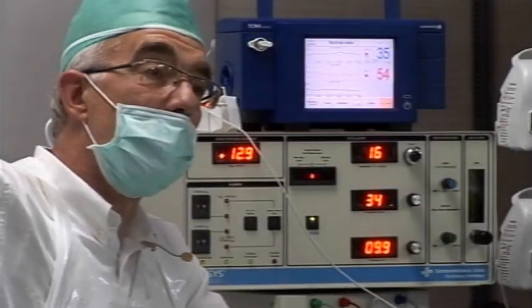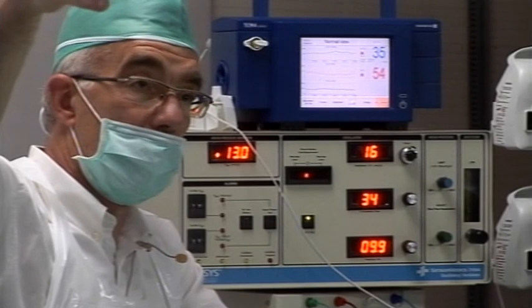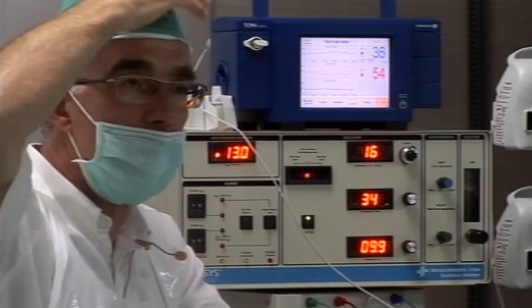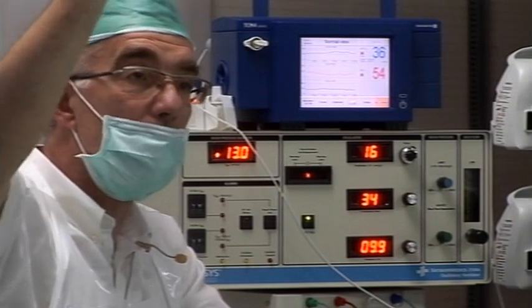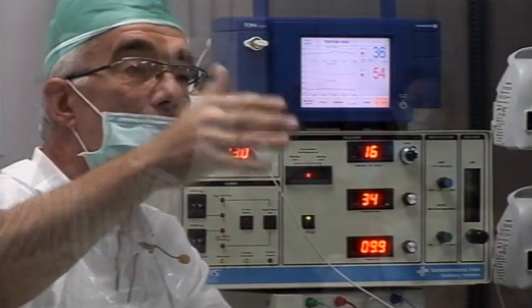I didn't show you the results, but after having done the Provo study in 1994, 1995, published in 1995, we were very happy because we stopped randomizing. So we stopped using conventional ventilation. The unique mode of ventilation was HFOV. We measured all parameters between 96 and 98, all included.